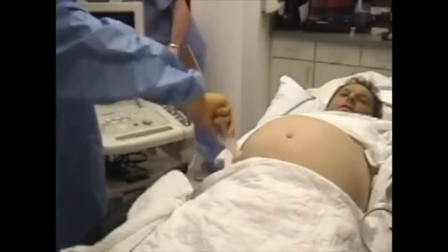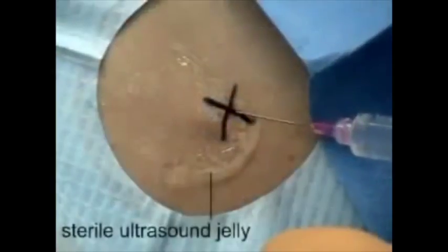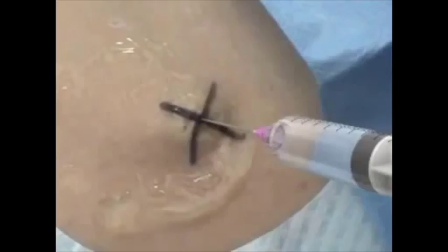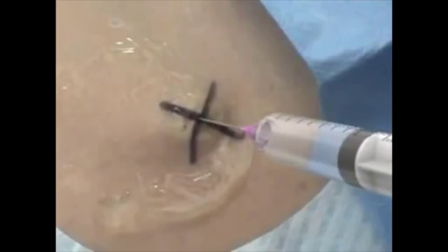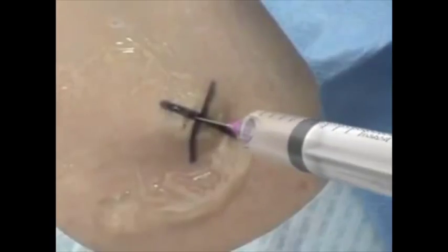The paracentesis needle should not pass through sites of cutaneous infection, visibly engorged subcutaneous veins, surgical scars, or abdominal wall hematomas. Prepare the site with an antiseptic solution and then apply a sterile drape. Using a 22 or 25 gauge needle, anesthetize the superficial skin with a wheel of local anesthetic such as lidocaine. Continue to anesthetize the deeper tissues in the anticipated tract of the paracentesis catheter, intermittently pulling back on the syringe every 2 to 3 millimeters.